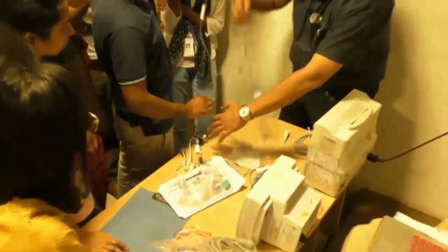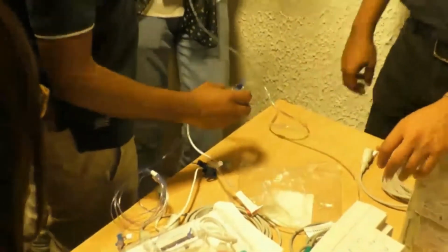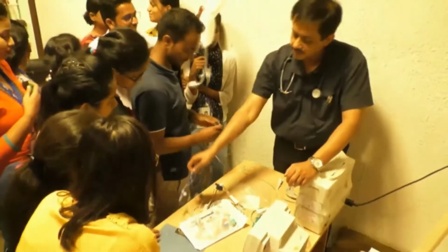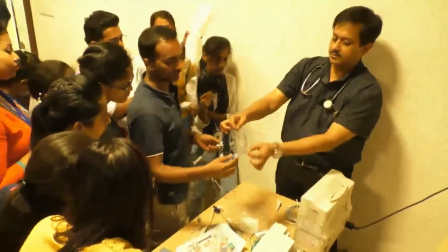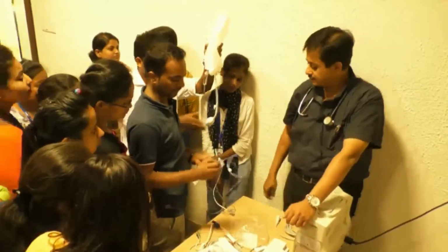No, this one we are not using, we are using this one. There is also a specification of the length of this tubing. It should not be more than 1.2 meters.